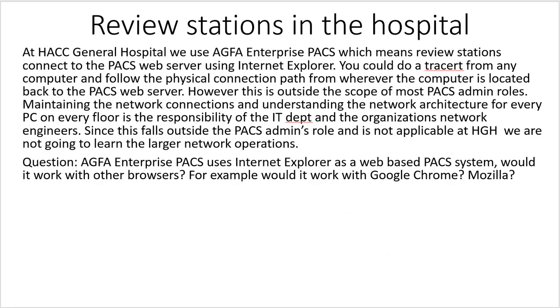Well, at Hack General Hospital, we use AGFA Enterprise PACS, which means review stations connect to the PACS web server using Internet Explorer. And you could do a trace route from any computer and follow the physical connection path from wherever the computer is located back to the PACS web server. However, this is outside the scope of most PACS admin roles, maintaining the network connections and understanding the network architecture for every PC on every floor. That's the responsibility of the IT department and the organization's network engineers.